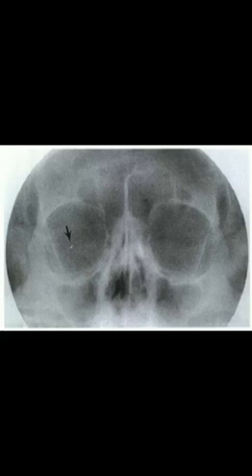Evaluation criteria: the following should be clearly demonstrated: petrous pyramids lying well below the orbital shadows, symmetric visualization of orbits indicating no rotation of the cranium, and a close beam restricted and centered to the orbital region.